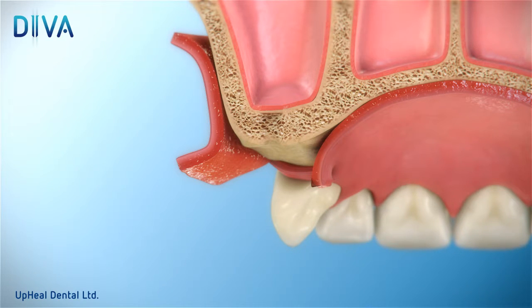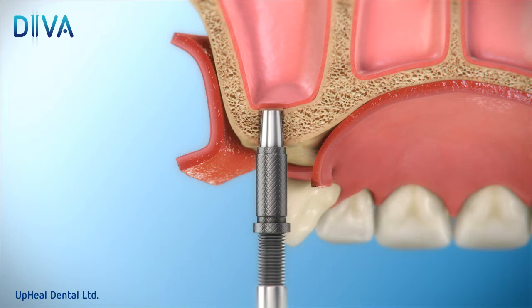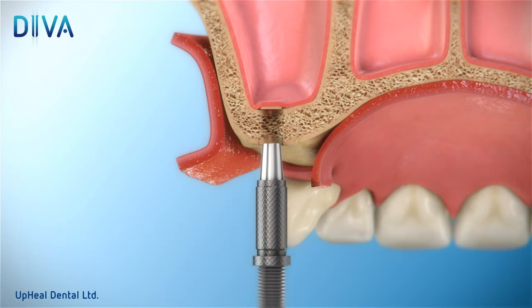Now, insert the special concave osteotome into the drilled space. Gently apply pressure until the first crack of the sinus floor cortical bone appears.